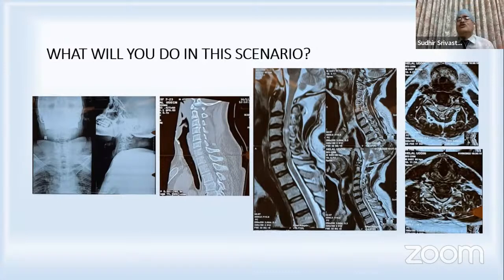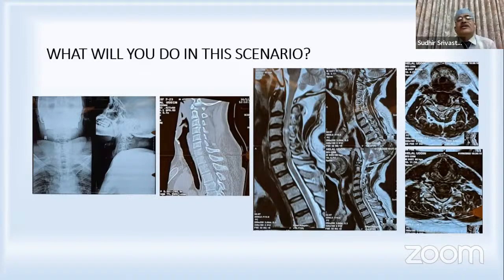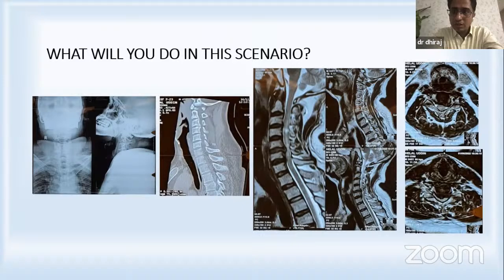Professor Srivastava, is there any sense of fracture dislocation of C5-6? Because there is a disc protrusion compressing the cord, and without a dynamic MRI, you cannot say whether the posterior ligamentous complex is injured or not. Actually, this is not, I would say, a Chance fracture. It is actually a discal injury. During that whiplash, the injury of the disc has happened and you can see there is a protrusion in that area. So these are the different components of trauma the patient has suffered. What has led to the significant deficit is the significant signal changes in the cord. Or it can be an already stenotic cord in which there was no CSF sleeve, and even a trivial fall can cause a deficit in such cases.